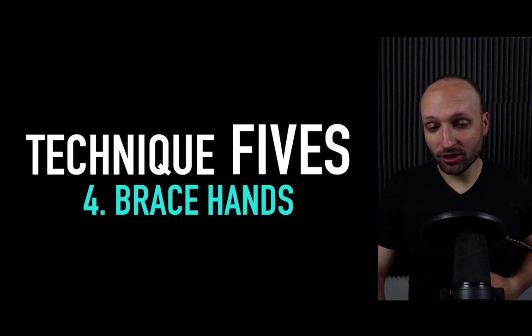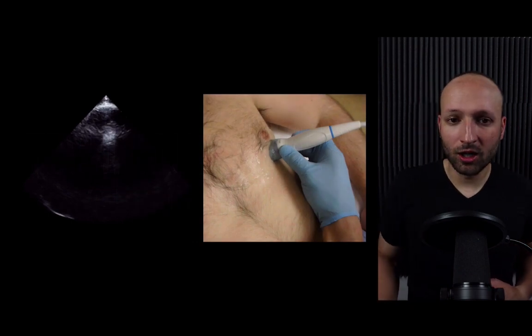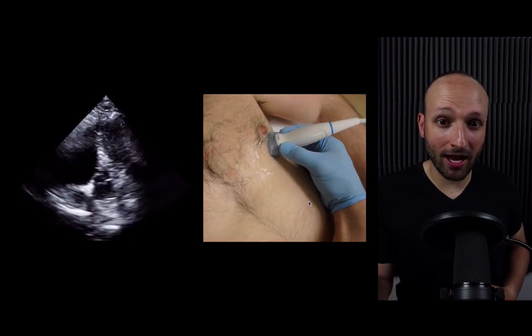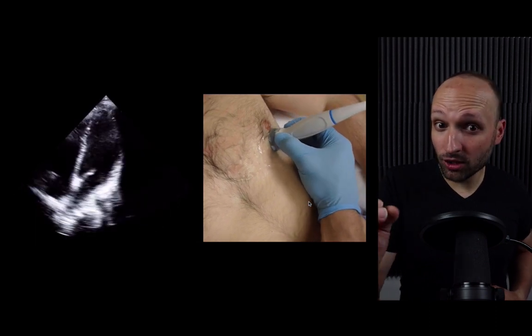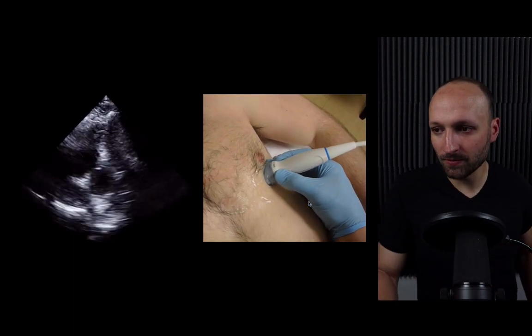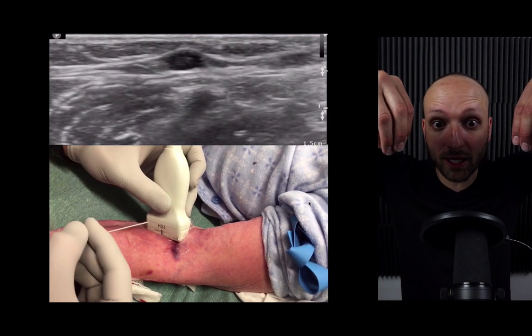Make sure that you brace your hands. For diagnostic ultrasound, this is important for fatigue and making sure that your arm doesn't move down. Look over here at my wrist. The palm of my hand is actually touching that patient's chest. First off, no excess pressure I don't need to put in. Second off, I'm not sliding anywhere, and I have really fine motor control. This is especially important when you have procedural-based ultrasounds. You don't want to have your arms floating up top, right?